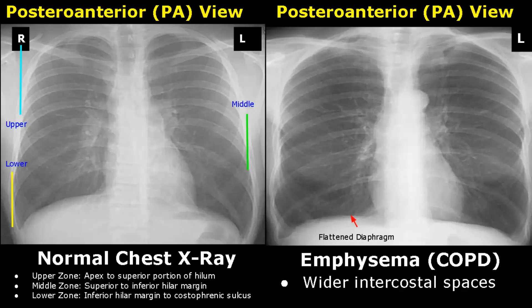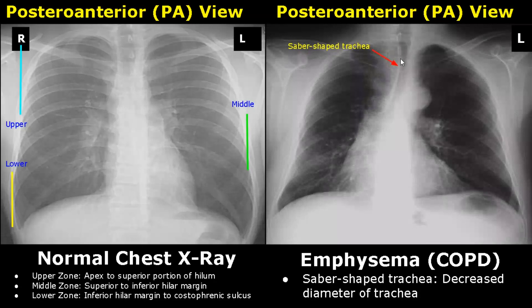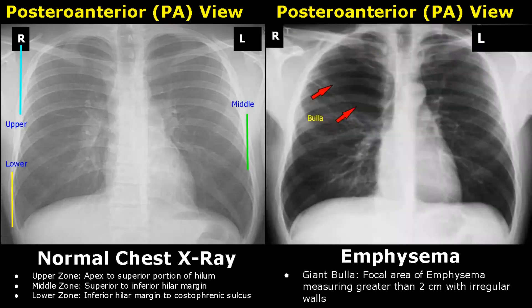A saber-shaped trachea may also be observed, due to decreased diameter of the trachea. Bullous changes may occur in some cases — a bulla is a focal area of emphysema measuring greater than 2 cm with irregular walls.